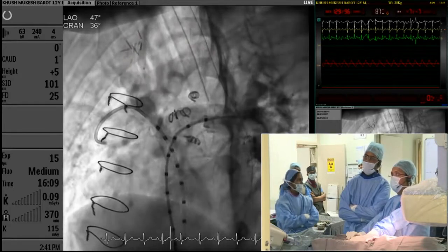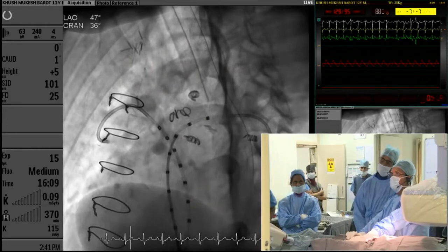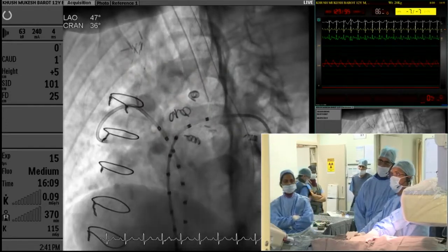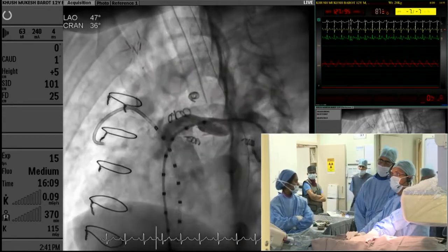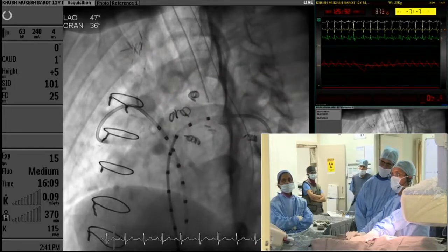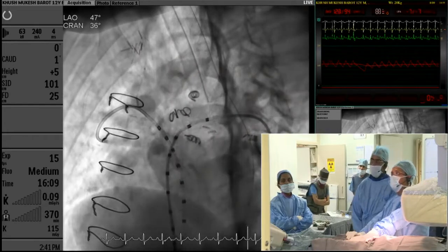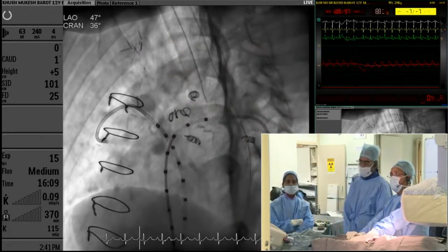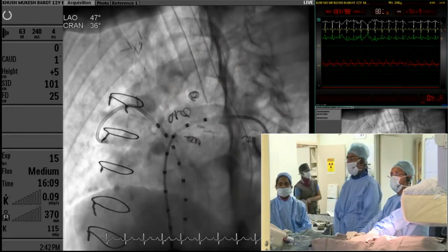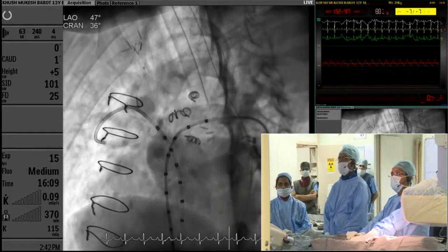And I would like to make one comment. What I have learned, looking at other people's cases also, and recently we had one case, is that when you do an LPA stenting, it's always a good idea to know the relationship of the left pulmonary artery to the left bronchus. I have seen many disasters in people trying to stent the left pulmonary artery, compressing the left bronchus and causing collapse of the left lung. So I think it's always a good idea to look at it CT-wise, to look at it fluoroscopically and so on.